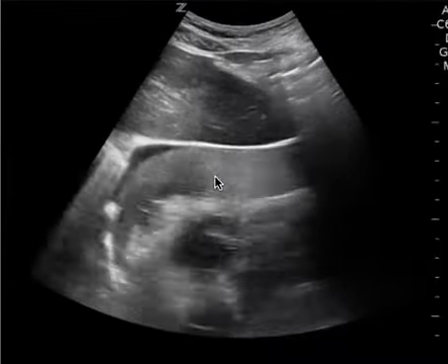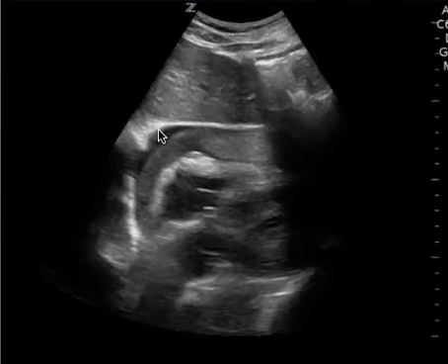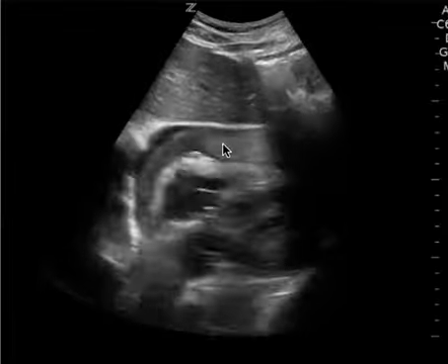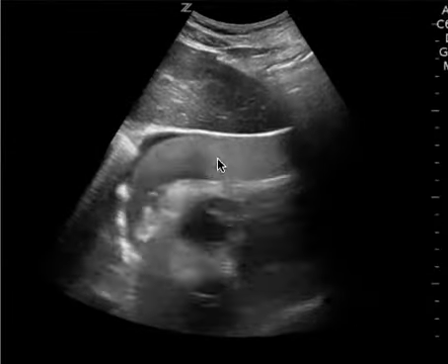Based on everything that you see here, just by sticking a needle you really only can take out what's here — the fluid portion. This is something that probably needs another intervention besides sticking the needle.